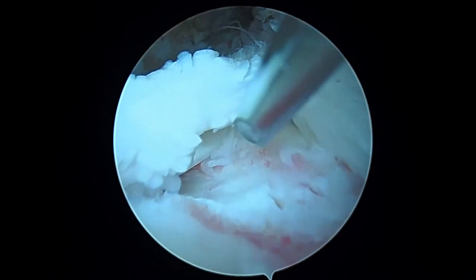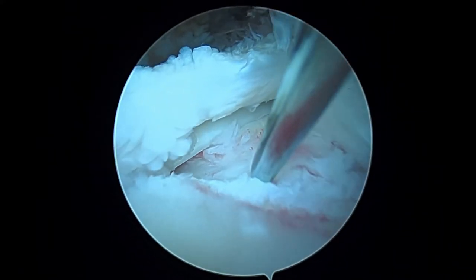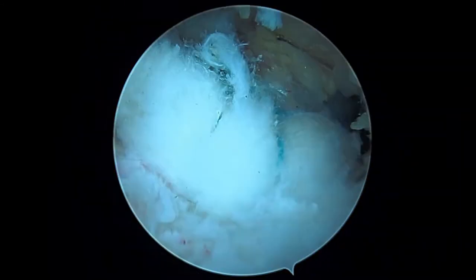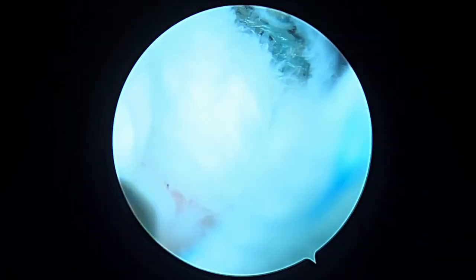We'll place the second anchor somewhere right about here. Remember how you could see the biceps tendon at the beginning of the case — when we're done, that's going to be all covered up. We'll place this one down right about here, have my assistant externally rotate the shoulder just a little bit, and get the guide in. There's our second anchor, and now we're going to get to work on these sutures, reaching in from the left side of the screen and working with them one at a time.